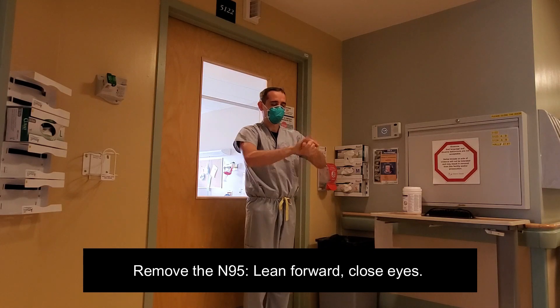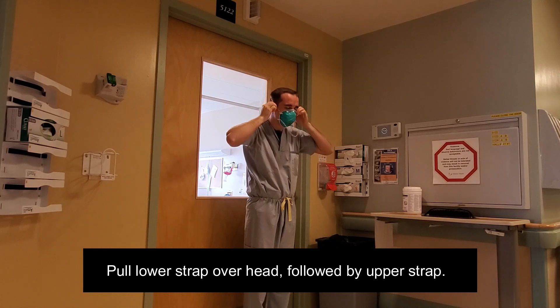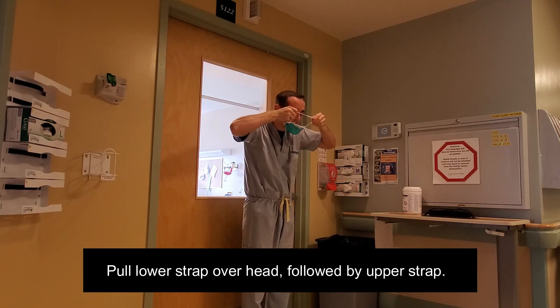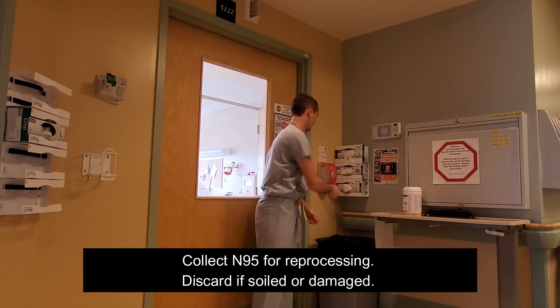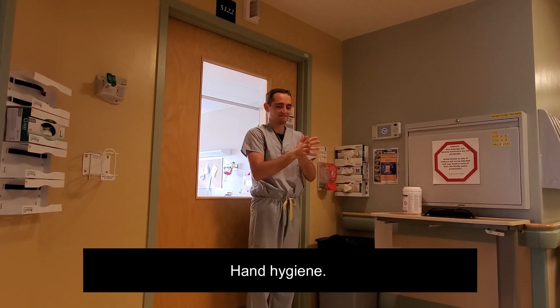Remove the N95 respirator by leaning slightly forward and closing your eyes. Pull the lower strap over the head first, followed by the upper strap. Collect the N95 for reprocessing, or discard it if it is soiled or damaged. Perform hand hygiene.